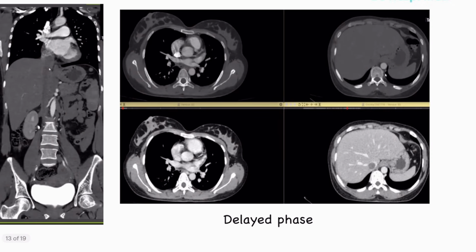I want you to see two pictures. This is a non-contrast study and this is with contrast. So when you have added contrast, can you see the thrombus in this IVC? This is the thrombus of this. This is the same patient which I showed you here. So had I not done a delayed phase, I would have for sure missed this large thrombus.